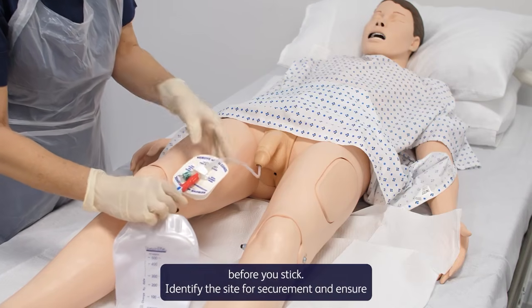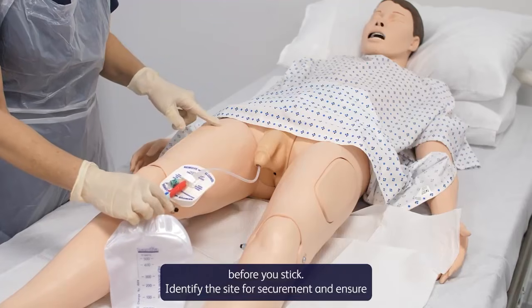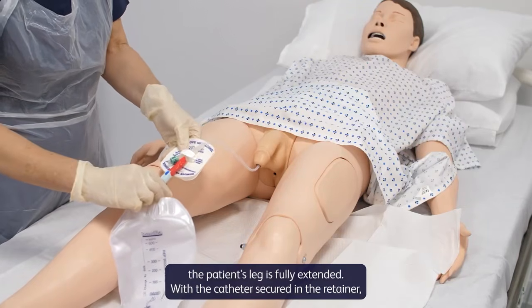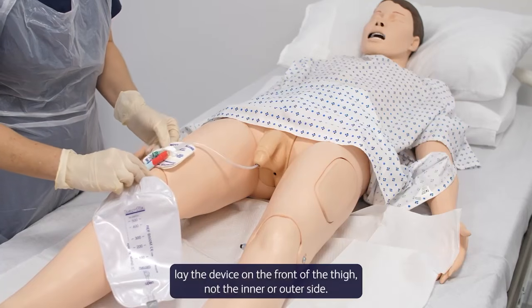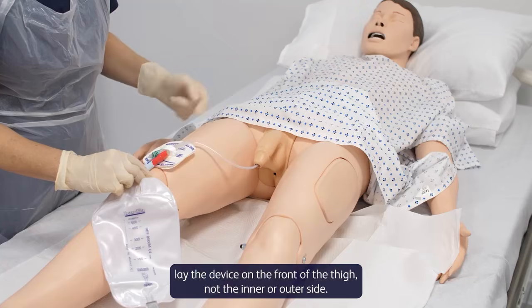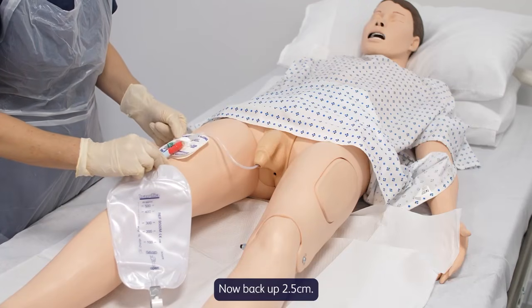Click before you stick. Identify the site for securement and ensure the patient's leg is fully extended. With the catheter secured in the retainer, lay the device on the front of the thigh, not the inner or outer side. Now back up 2.5 centimeters.